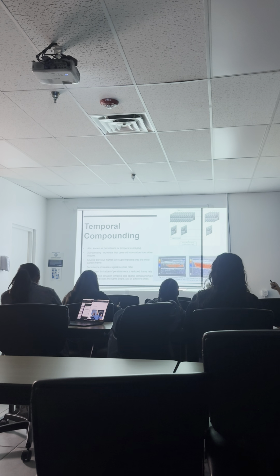More processing time does what to temporal resolution? It degrades temporal resolution. Okay, so this is a give and take.